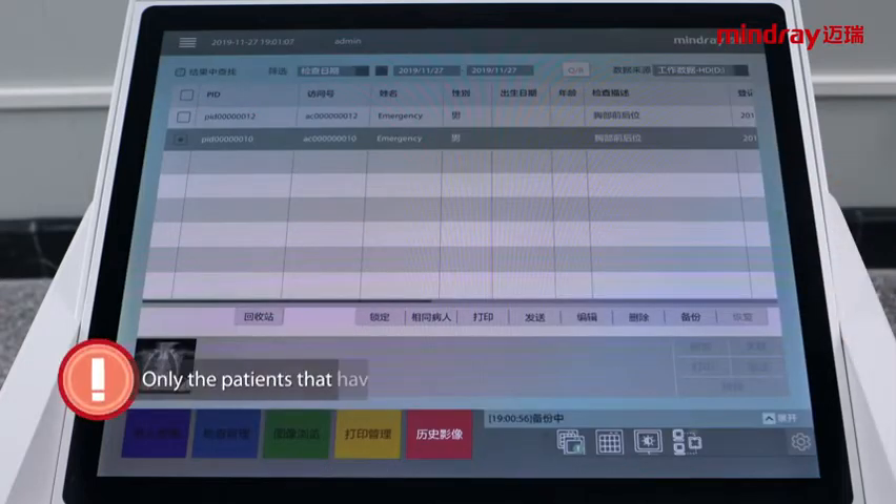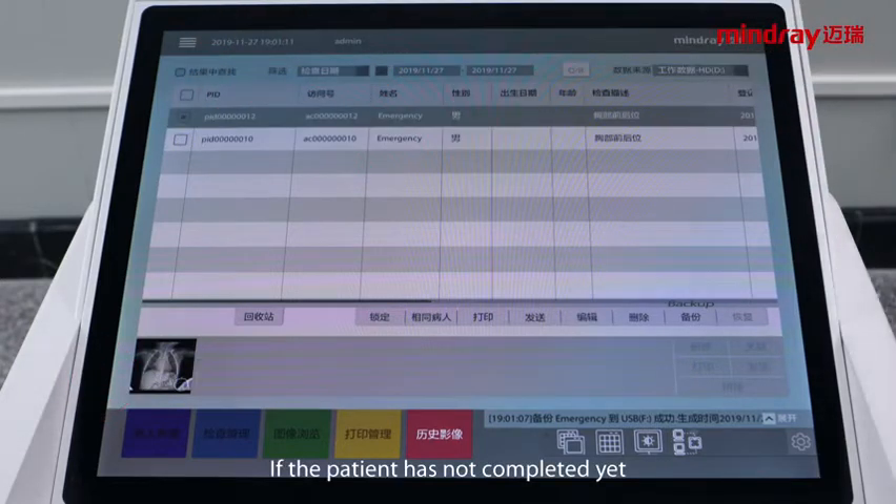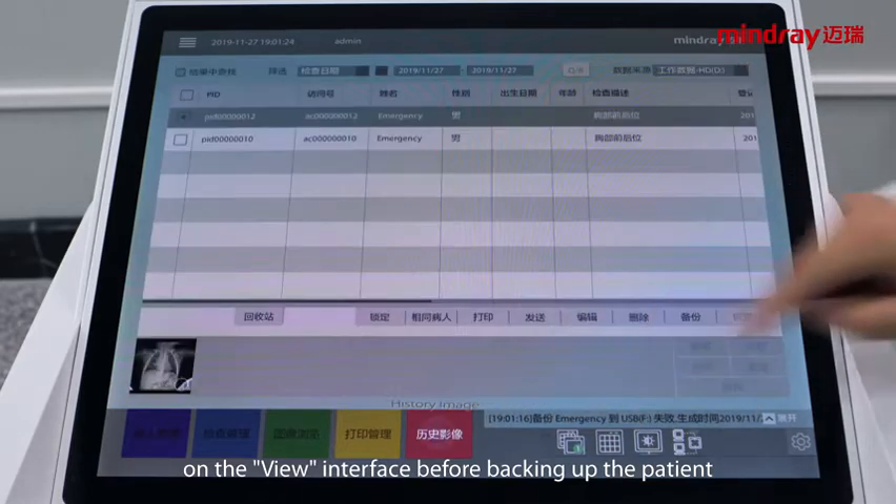Note: only patients that have been fully examined can be backed up. If the patient exam has not been completed yet, the backup will fail. In that case, you need to close the patient on the workflow interface before backing up.